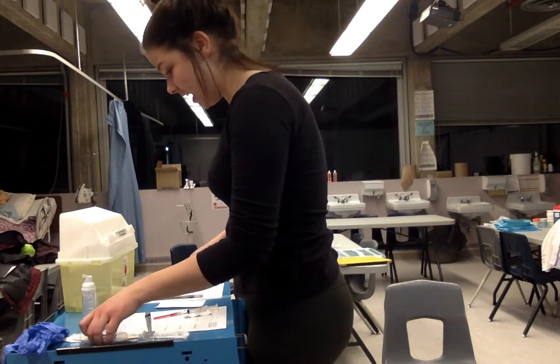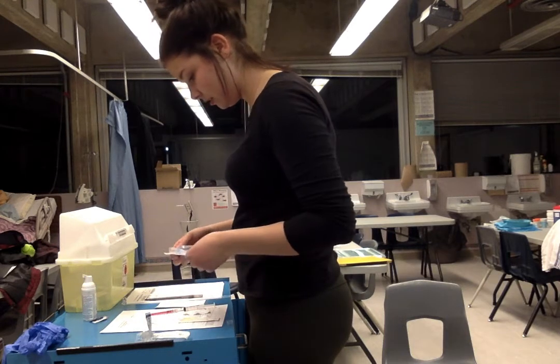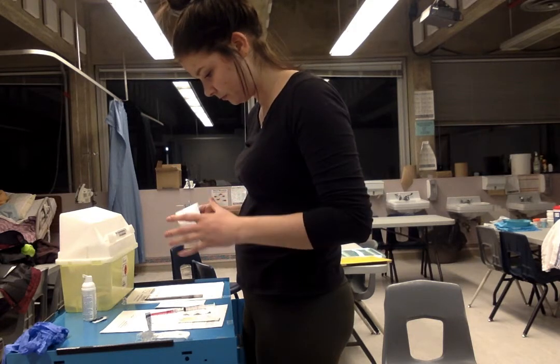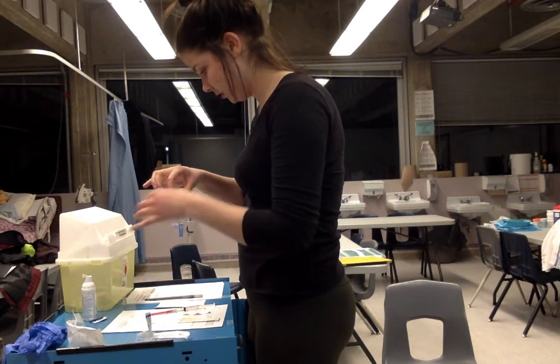All right, now I have my line that I need to prime.